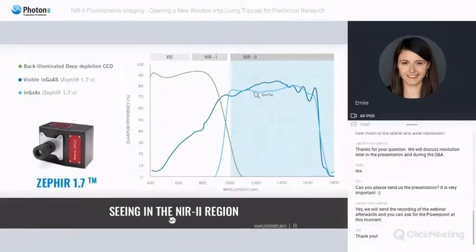This is a range that can be detected quite easily with the indium gallium arsenide sensor, which we call InGaAs sensors. They've been around for quite a long time, but they were limited mostly to military applications due to some restrictions on their use and also the high costs. But in the last few years, the cost went down and they have become increasingly popular for scientific applications.